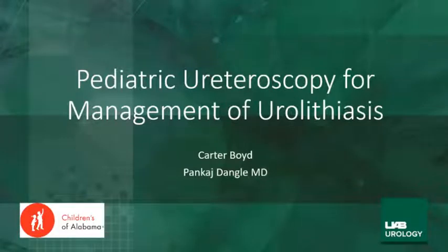With the rising incidence of pediatric urolithiasis, pediatric ureteroscopy has become a common endourological procedure in patients with kidney and/or ureteral stone disease. Most patients present with an acute episode of renal or ureteral colic to the emergency department. Imaging is based on the hospital protocol, either with KUB and renal bladder ultrasound, or with low-dose non-contrast CT scan.